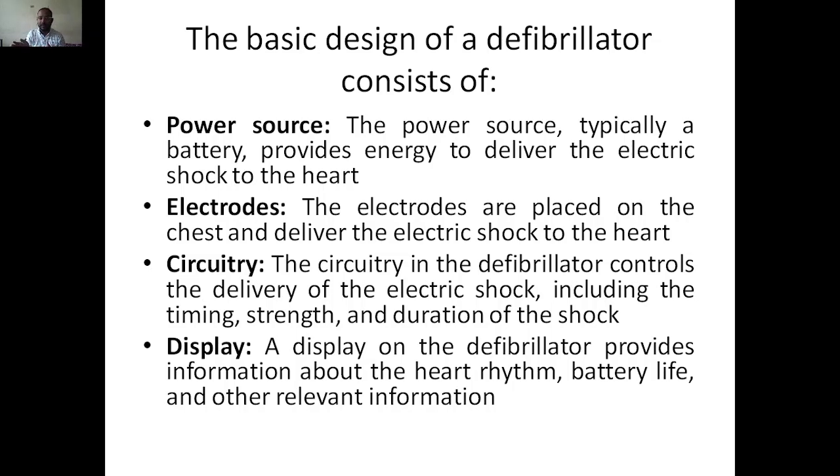That's why whether the battery life is there or not should be shown, because when a person has had a severe accident and suddenly his heart starts beating slow, and they see that the heart is going to experience a heart attack, then they will have to give the defibrillator shock. So when you are going for the defibrillator, if the battery is 10%, 5%, they cannot operate, right? So in this display it should have the heart rhythm, how it is functioning, and the battery life, and also other relevant information like oxygen level, everything will be there in this particular display.